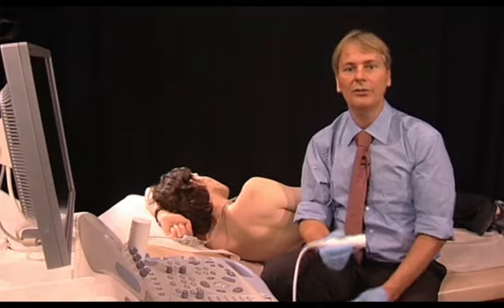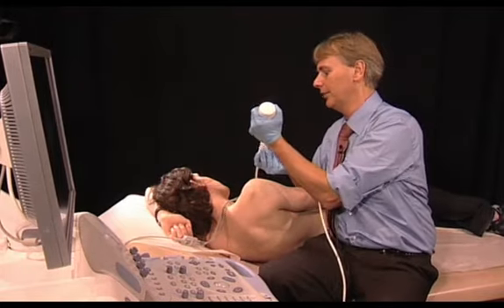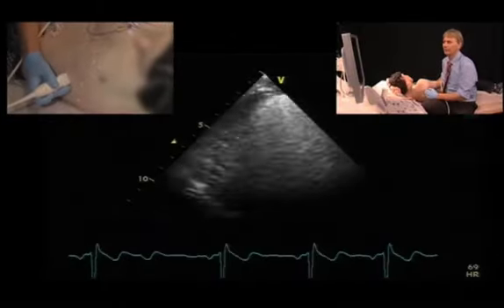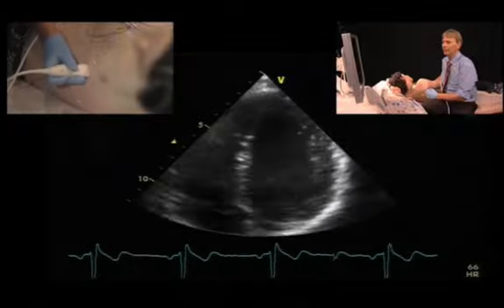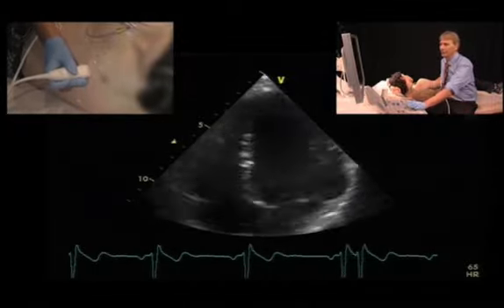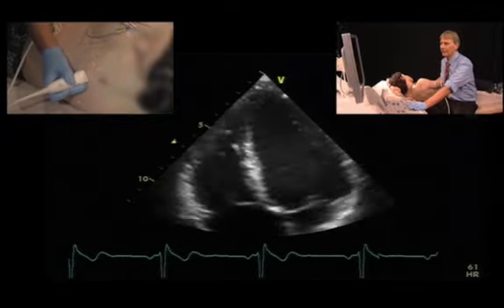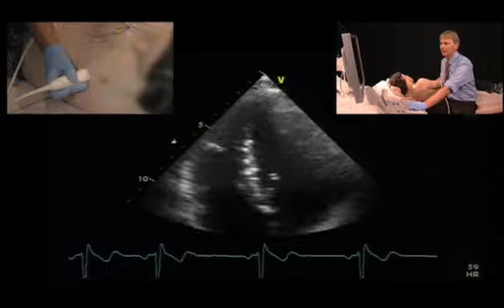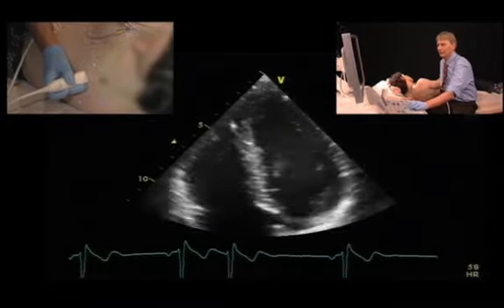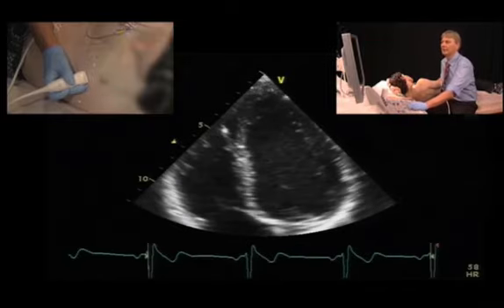To quantify the volumes, the most important thing is to get a good image quality of a 4-chamber and a 2-chamber view. So I'll show you some of the pitfalls or some of the problems. One problem usually is that we do not get a good resolution in the lateral wall. So often it's good to have the patient exhale a bit. And then once you get good image quality, let's increase the gain a bit. We can freeze the image.